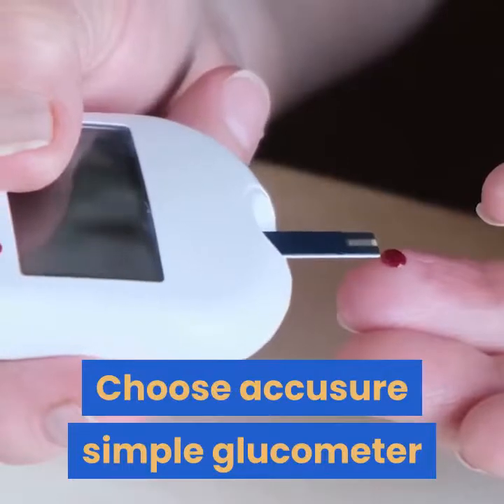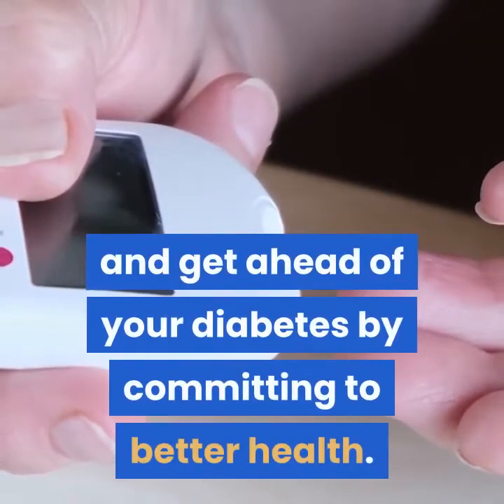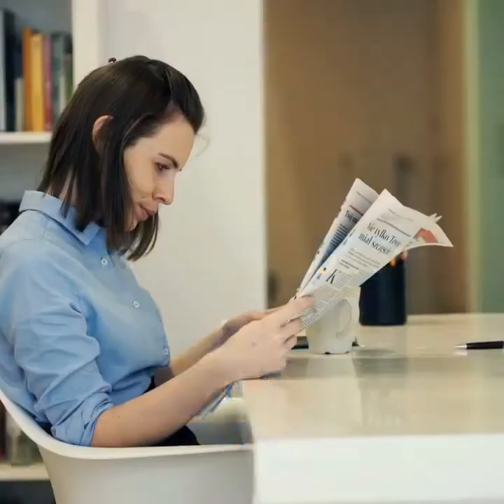Choose the AcuSure Simple Glucometer and get ahead of your diabetes by committing to better health.